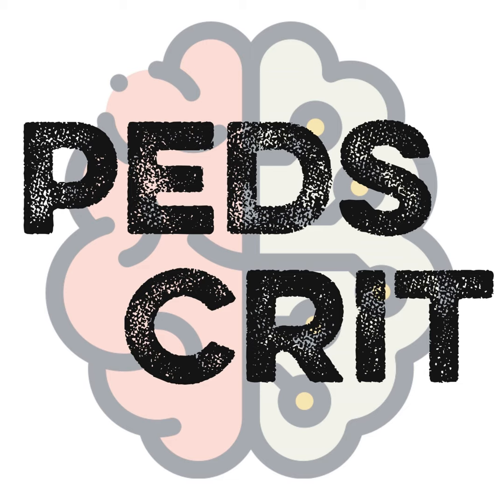And then we have centrifugal pumps. So RPMs are directly proportional to your flows. Once your flows are established, you slowly increase your RPMs, you get to maximum flow and make sure that everything flows intact. And then what we do typically is, once the flow is established, we check what the patient's NIRS are. And obviously we have a console attached. The pump we use is CardioHelp, and you see a console, and you have a direct live transmission of your venous saturation there.